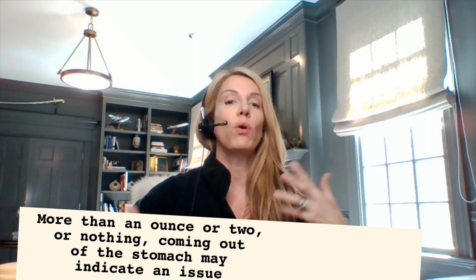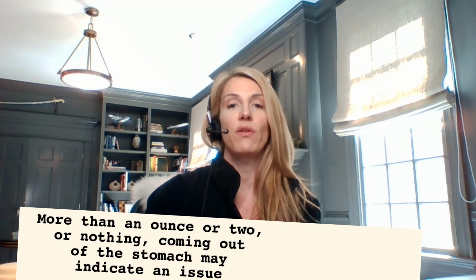Venting can show us how much food is coming back out into the syringe. So if you're in the beginning of a meal and the stomach motility is optimal because the stomach is pretty empty and your child is hungry, you likely won't see a whole lot of food coming back out of the syringe. However, if you're closer to the end of a meal, it would be more expected to see more food coming out of that syringe. But a lot of excess food coming out of the syringe, like more than about an ounce or 35 milliliters, may indicate a few things.